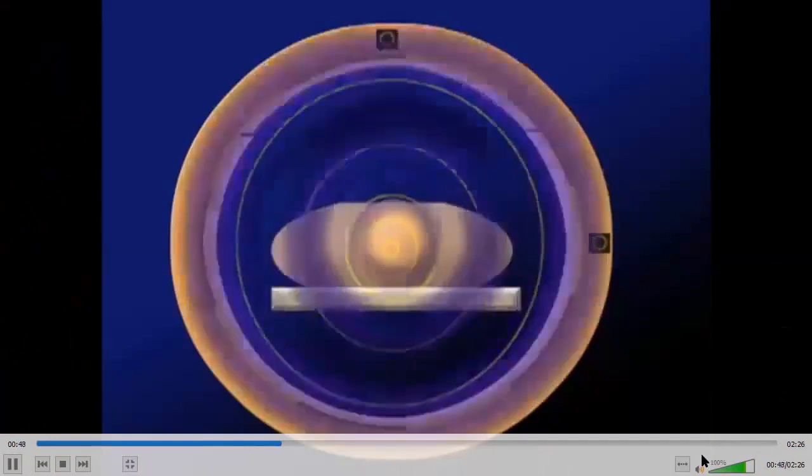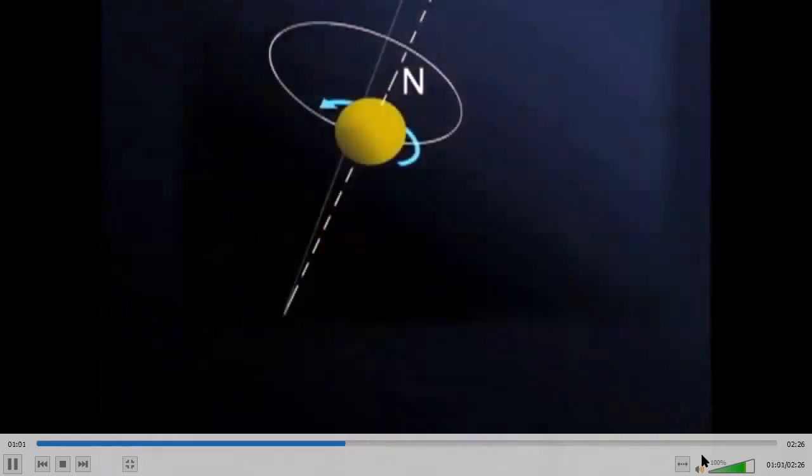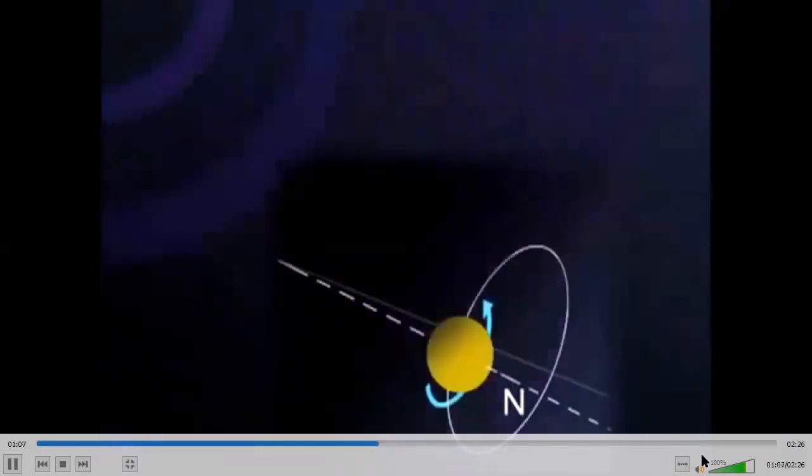Now put on a radio frequency pulse, say 60 megahertz. Then you can turn the magnetization of your hydrogen nuclei 90 degrees away from the direction of the magnetic field. Your magnetic moment will precess.